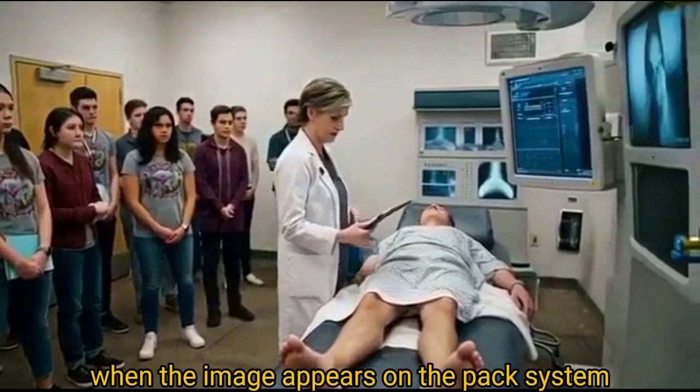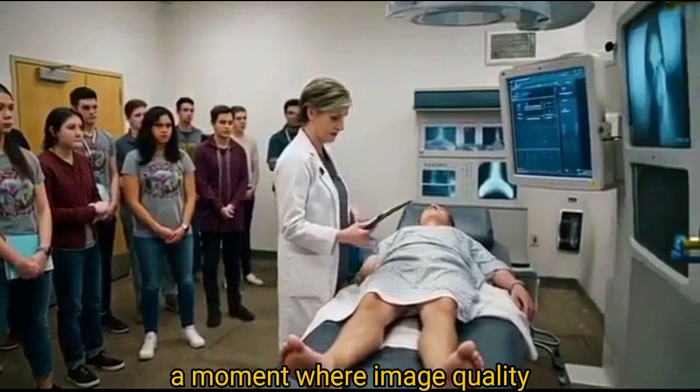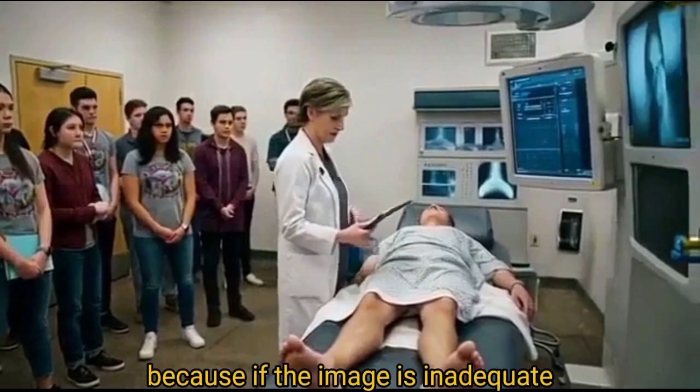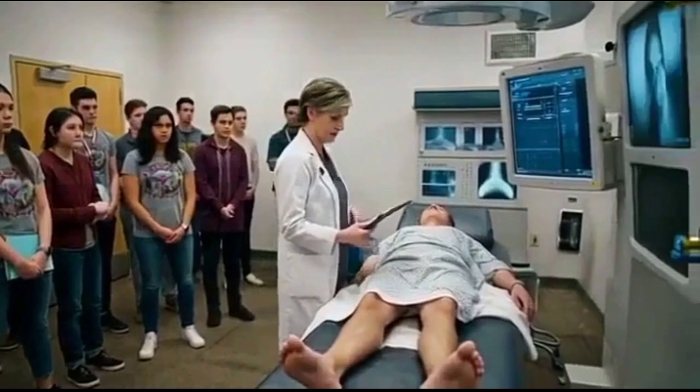When the image appears on the PACS system, that moment is critical. It is not just image acquisition. It is a clinical checkpoint. A moment where image quality, positioning accuracy, and diagnostic adequacy are confirmed. Because if the image is inadequate, diagnosis may be delayed even when disease is present.